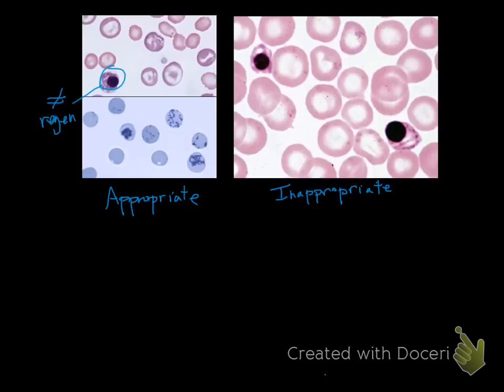If you see these in circulation, they're increased, that is not a regenerative anemia, but they can accompany regeneration. If they accompany regeneration, remember, these are all our polychromatophilic red cells, and there's a lot of these compared to this one nucleated red blood cell. So that's appropriate when they accompany that.